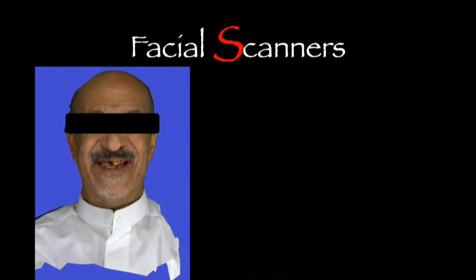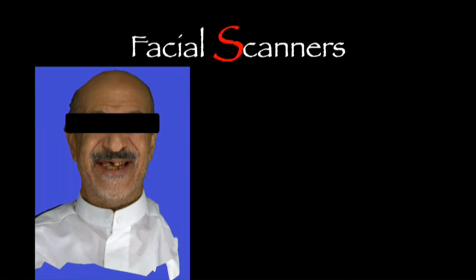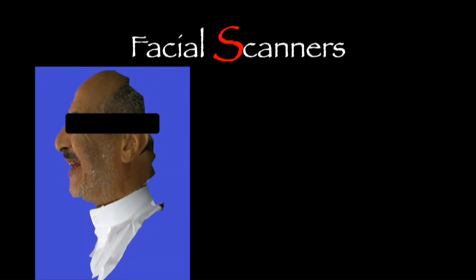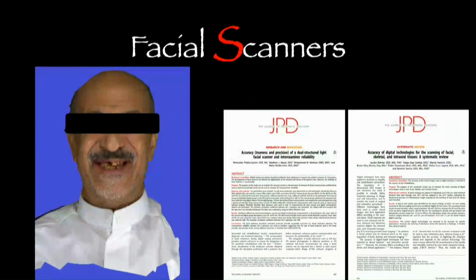Now, another topic that I find very interesting is the current push for facial scanners in the market. By concept, as I said before, this is very interesting because we can import the digital data that we have in our software and merge it with the facial scanner so we can have a more dynamic, facially driven planning, at least by concept.